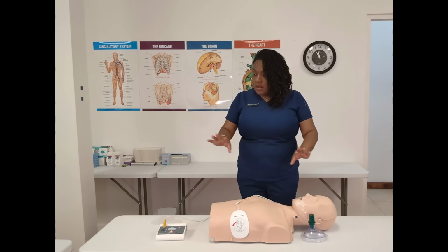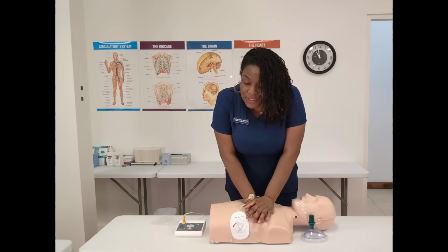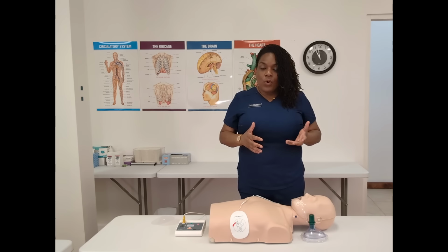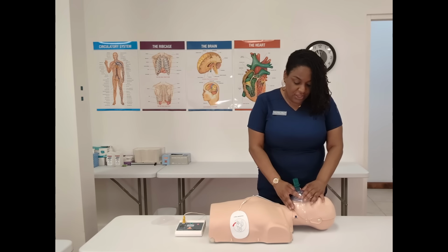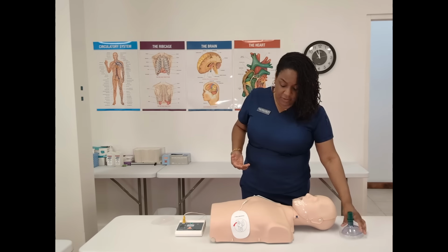The tone that you hear, that beeping, is called a metronome. It helps you keep the pace of your compressions. So if you go too fast, slow it down and go with that metronome. The metronome ensures that you're allowing for chest recoil and that you're compressing between 100 up to 120 compressions per minute. And if you still have your pocket mask or one-way valve, after your 30 compressions, you go back and give your 2 breaths. For classroom purposes only, I am turning off this AED because I don't want to talk over it. It's a little bit distracting.